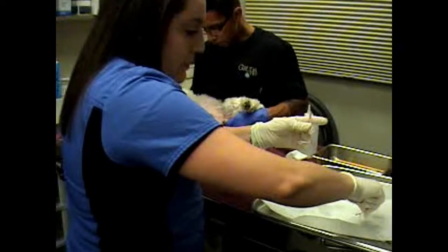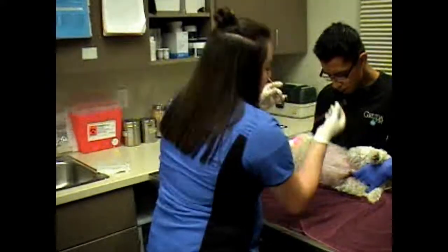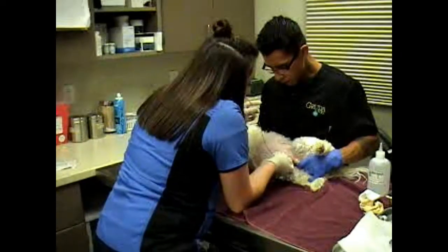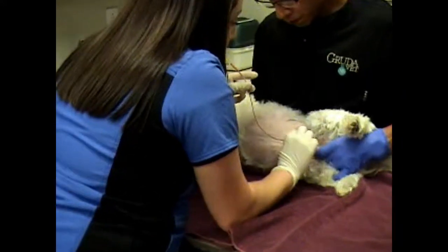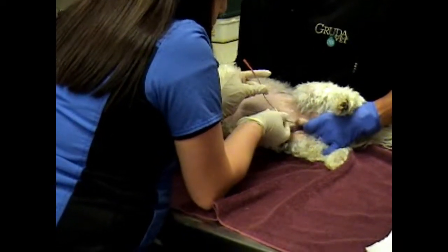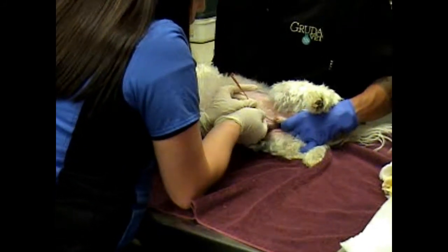I'm just going to dip the eye of the catheter into the sterile lube, and then I'll go ahead and feed the tip of this catheter just very gently into the penis until my little mark here, which is just right at my fingertip, and just keeping my fingers right on the catheter itself. And that way I'm not touching any of the hair.